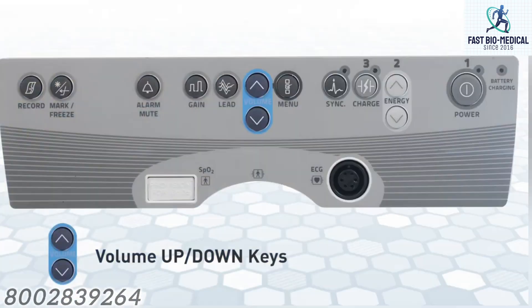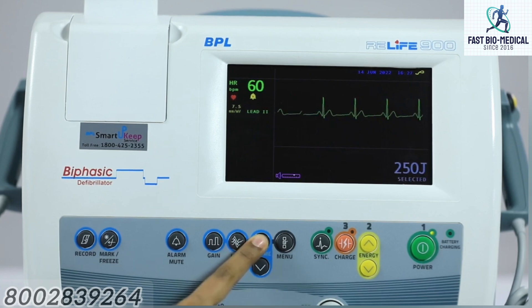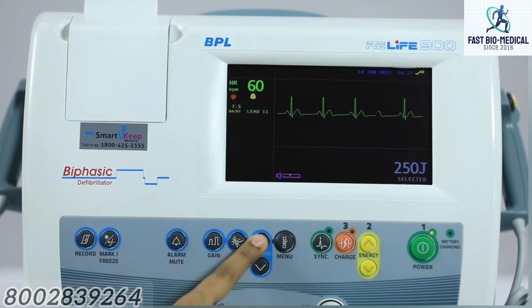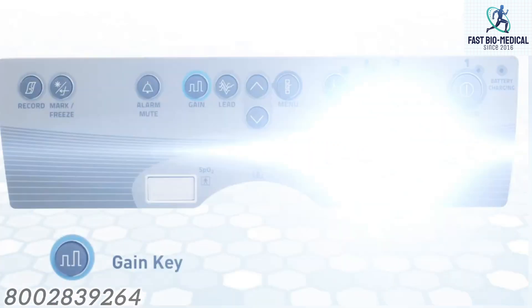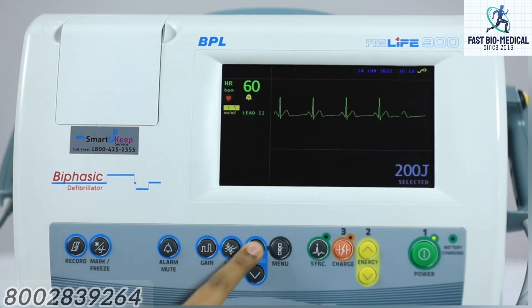Volume up/down keys change the volume of the QRS beat tone. Pressing down decreases the volume and pressing up increases the volume. Lead key selects the ECG lead to be displayed on the screen; volume up and down keys are used to select the ECG source lead. Gain key is used for changing the gain of ECG; volume up and down keys are used to modify the gain settings.